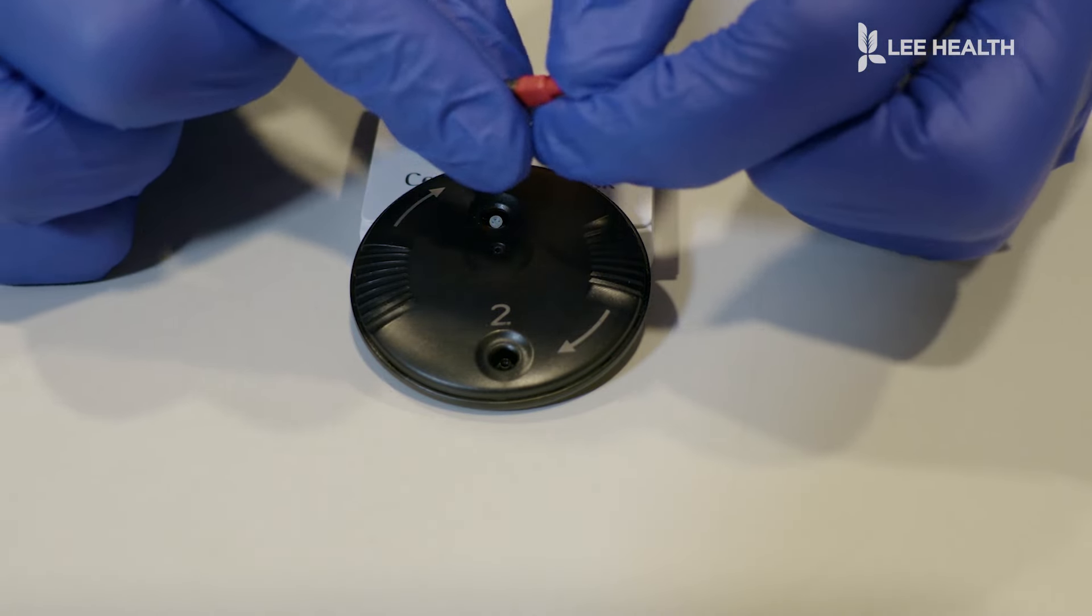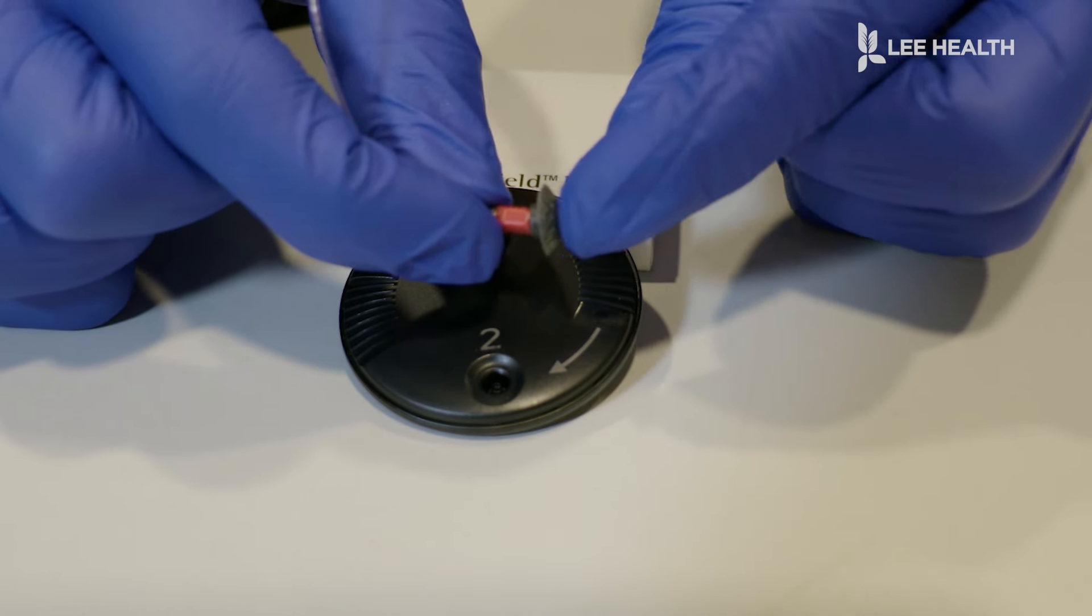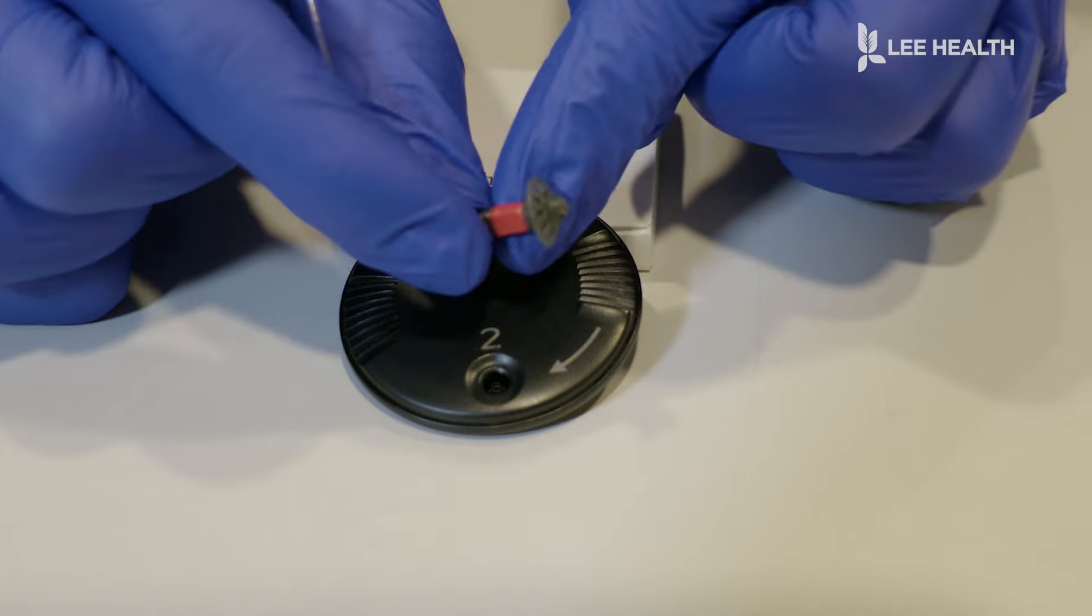We then just connect our dome piece back right underneath, really wiggling it, wiggling it on there nice and tight. And now that's all fresh and good to go.